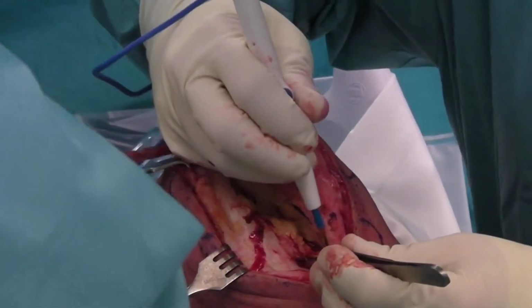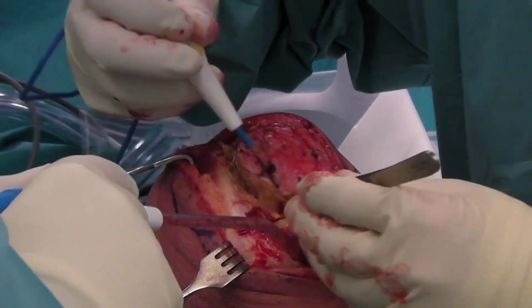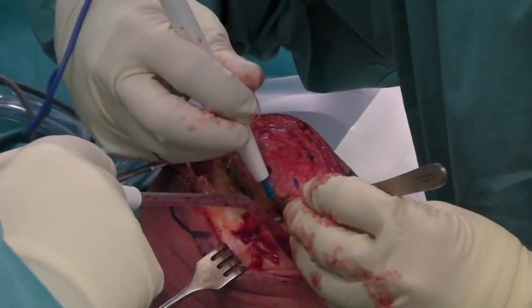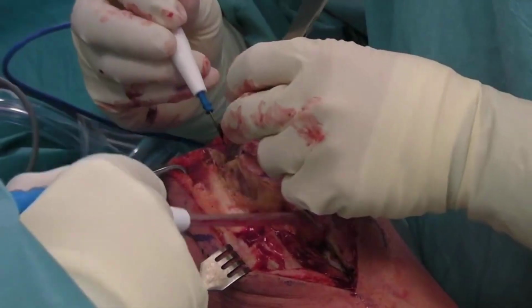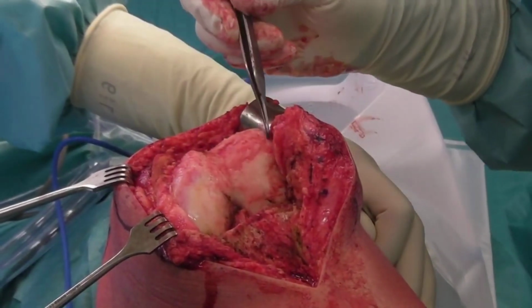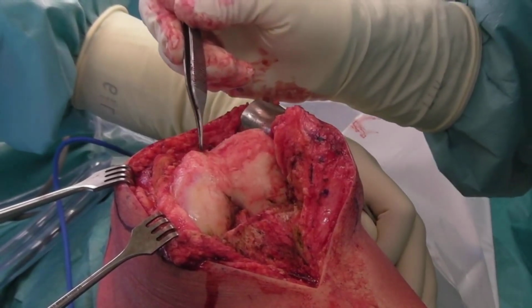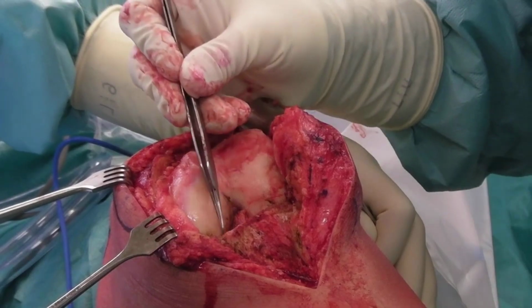Opening the joint capsule involves moving the patella, to which the quadriceps tendon and patella tendon are attached. The patella is moved toward the outer edge in order to have a perfect view of the articular surfaces of the femur and tibia.